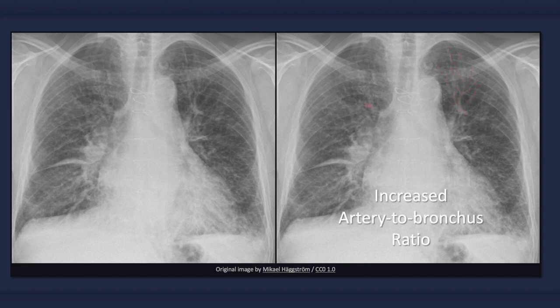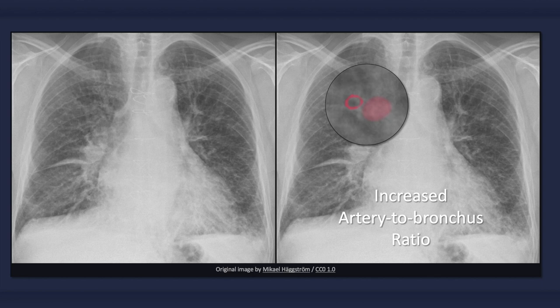One way it can be identified is by the discovery of a superior lobe artery with a greater diameter than its accompanying bronchus. Since it is hard to be certain on this radiograph, this example should be taken for illustrative purposes. The bronchus is the ring-like structure with a hollow center while the artery is filled in. Normally the upper lobe artery-to-bronchus ratio is less than 1 to 1, but here the reverse is seen, with a larger artery than bronchus.